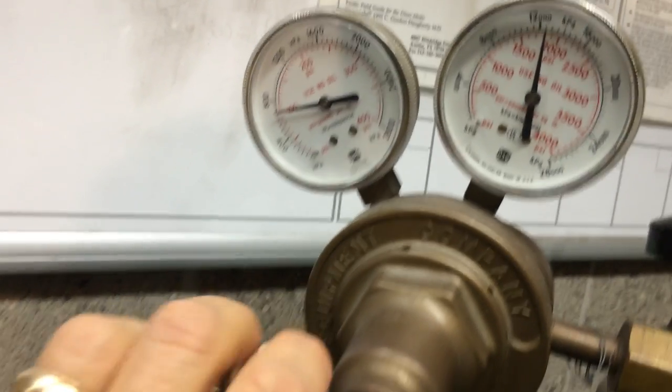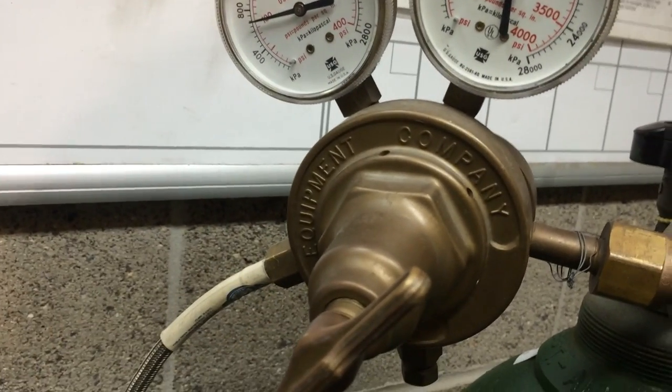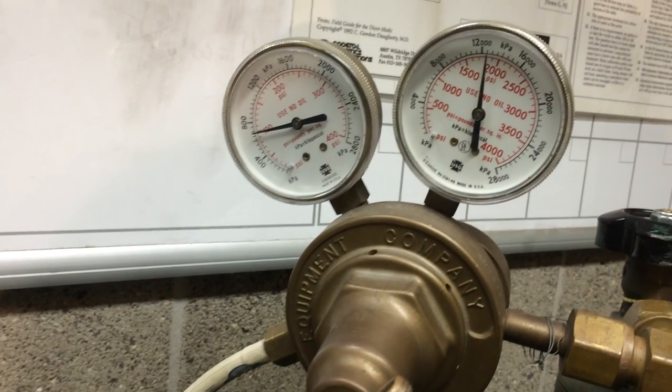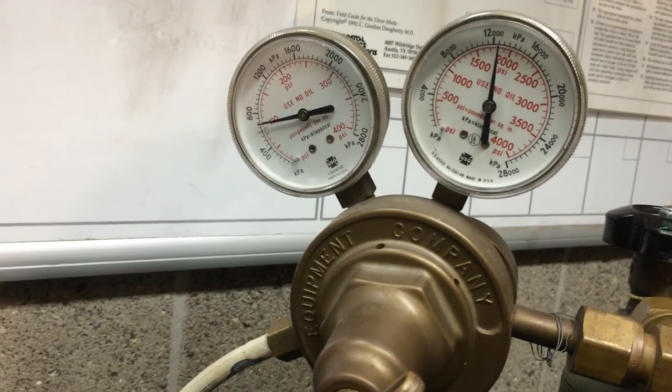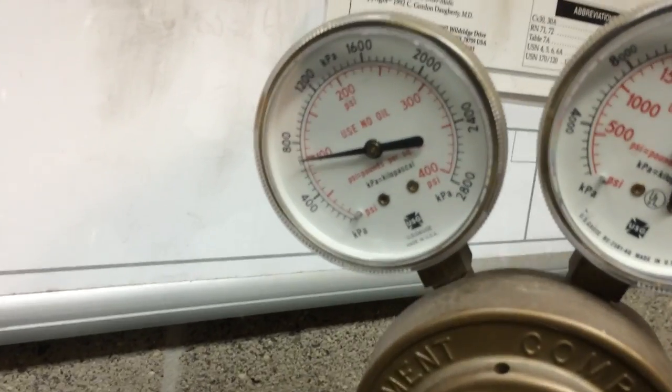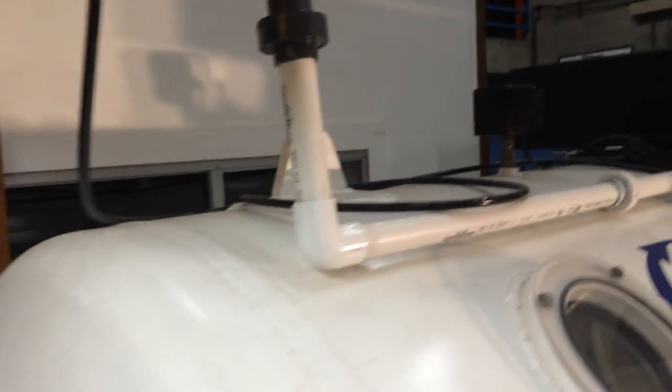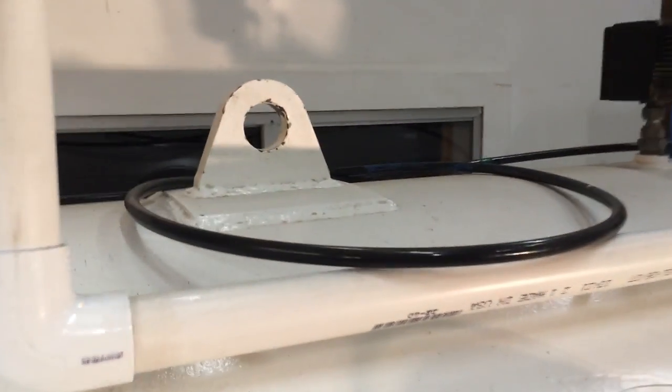If you back off the dial, that pressure will not reduce because it's not self-venting. It's very important to understand that the masks inside have to be either bled or breathed off to reduce that line pressure, and then the gauge will come down. Following the low pressure hose, it's delivered into the chamber, goes up through the beams and through some hard piping.